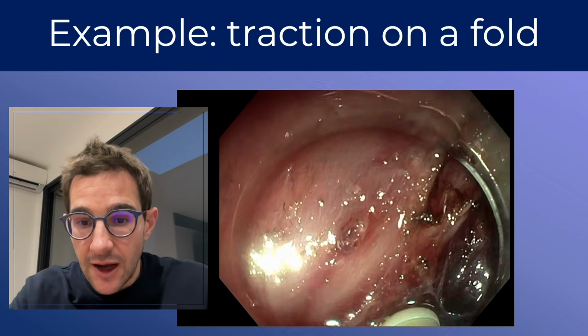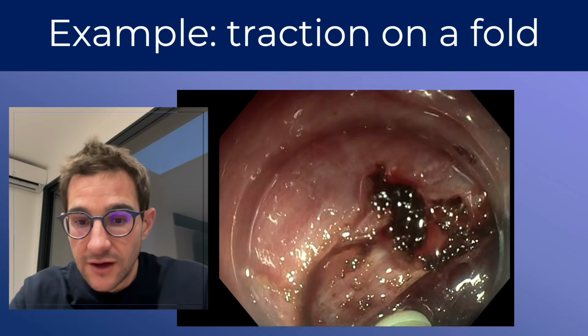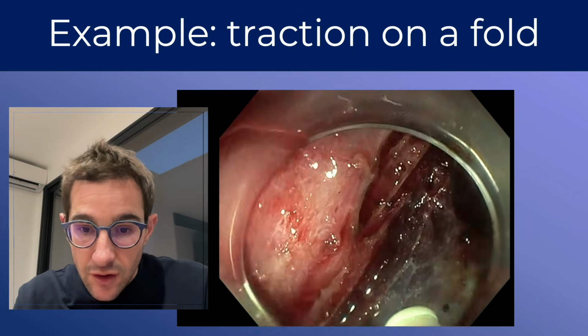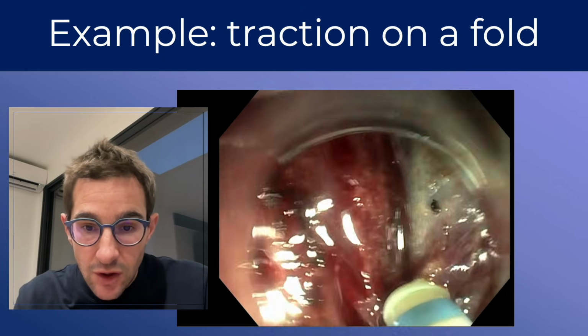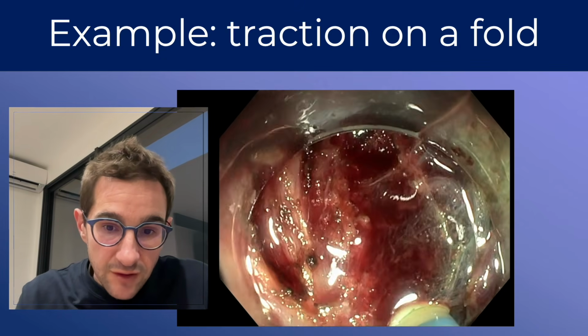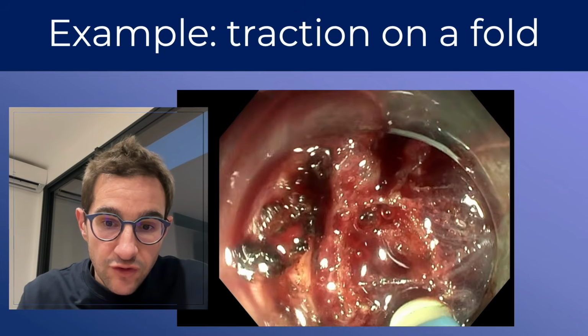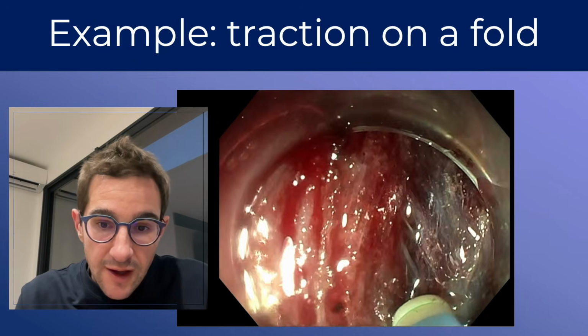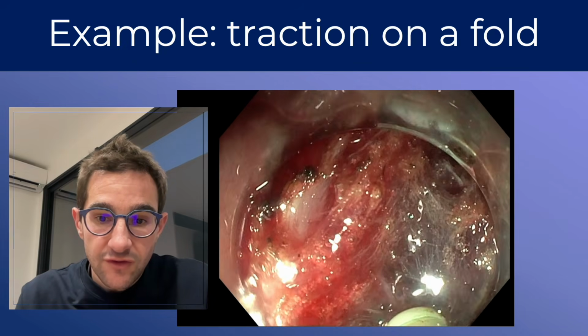And here I probably choose the third one, number 3, in order to have a cut which is relatively close to the muscle in order to have a deep margin, but with control on the muscular layer in order to avoid contact with the muscle and also contact with the specimen.